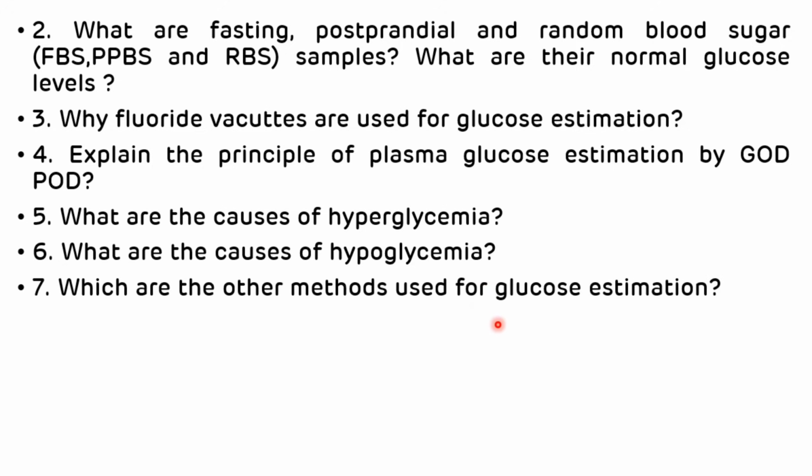What are the other methods used for the glucose estimation? We have already discussed in the beginning that there are various reduction methods, condensation method, and enzymatic method. In that, the enzymatic method is more specific.